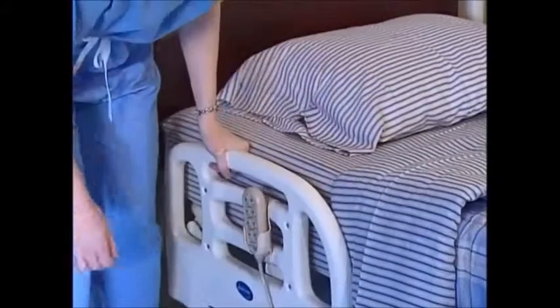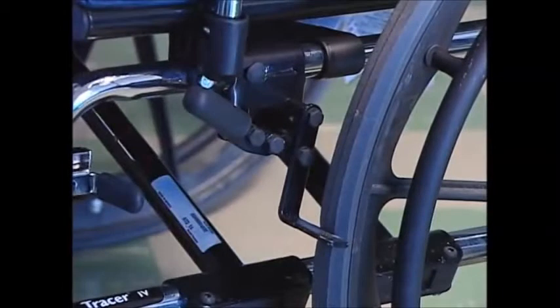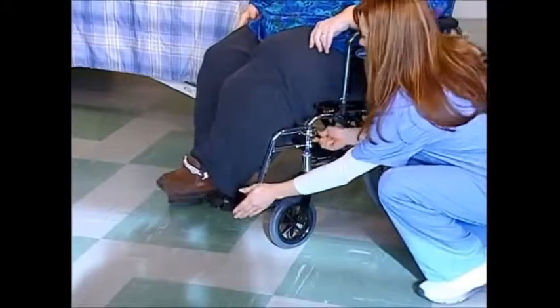Before performing the lift, engage the brake on the bed. Then, lower the rail on the side that will be receiving the lift. Move the resident and wheelchair as close to the bed as possible. Engage the wheel locks on the wheelchair. Move the front riggings out of the way.